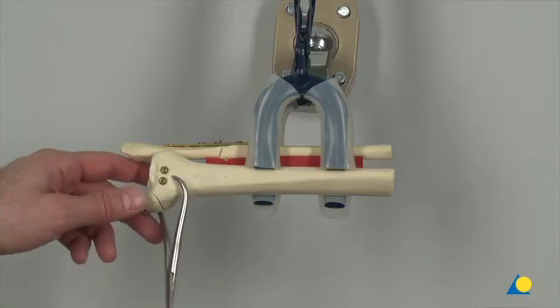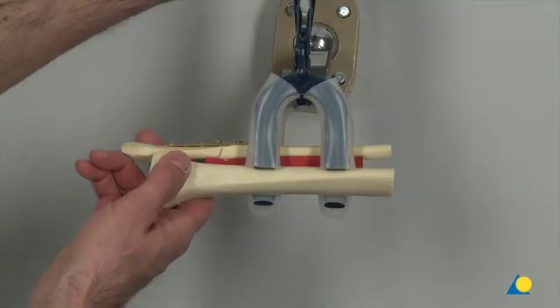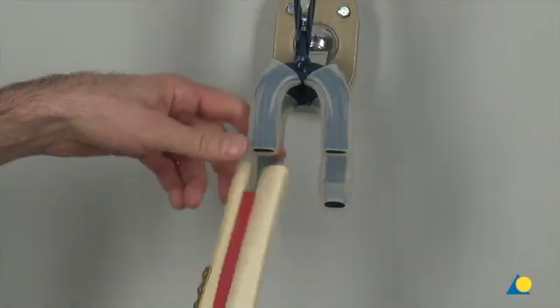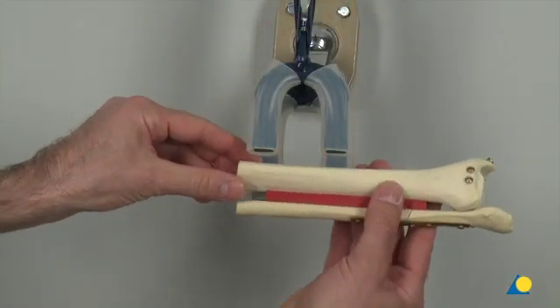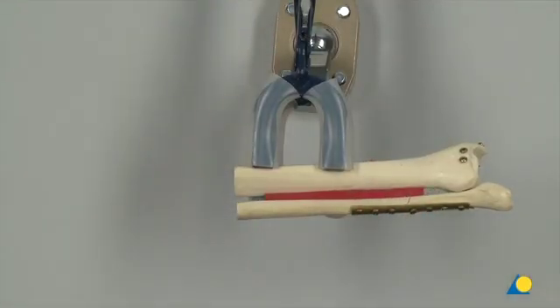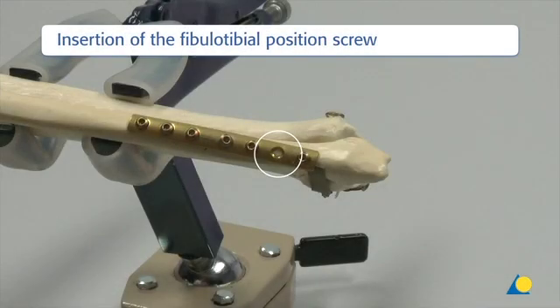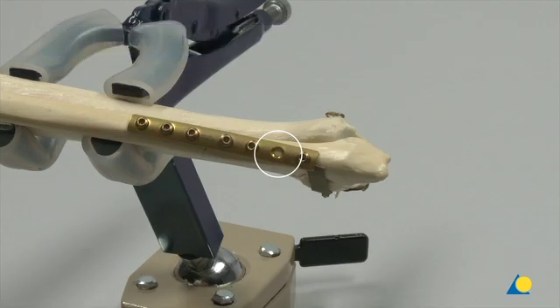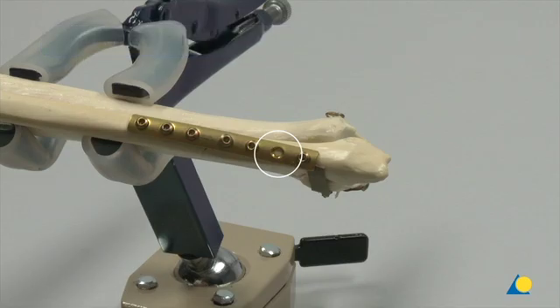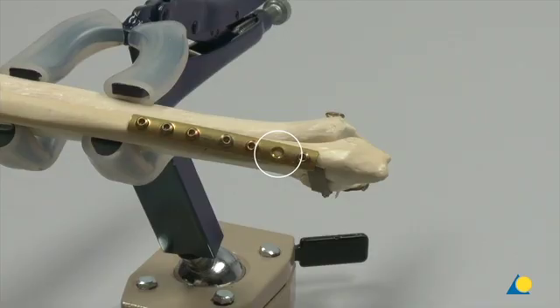The reduction forceps is removed. To facilitate the insertion of the position screw, the bone model has been returned to its original position. In the clinical situation, the ankle is dorsiflexed for the insertion of the positioning screw. This ensures that the upper ankle joint is at its widest position.